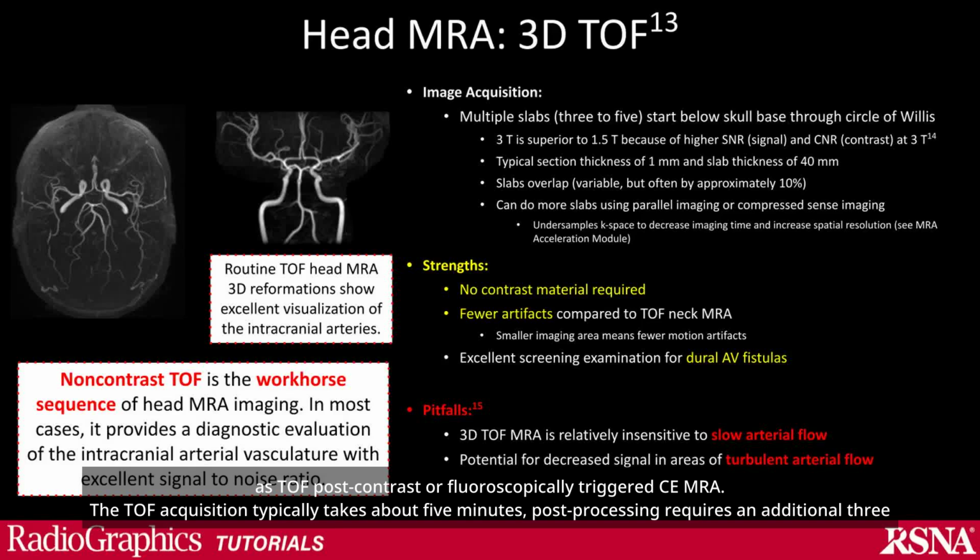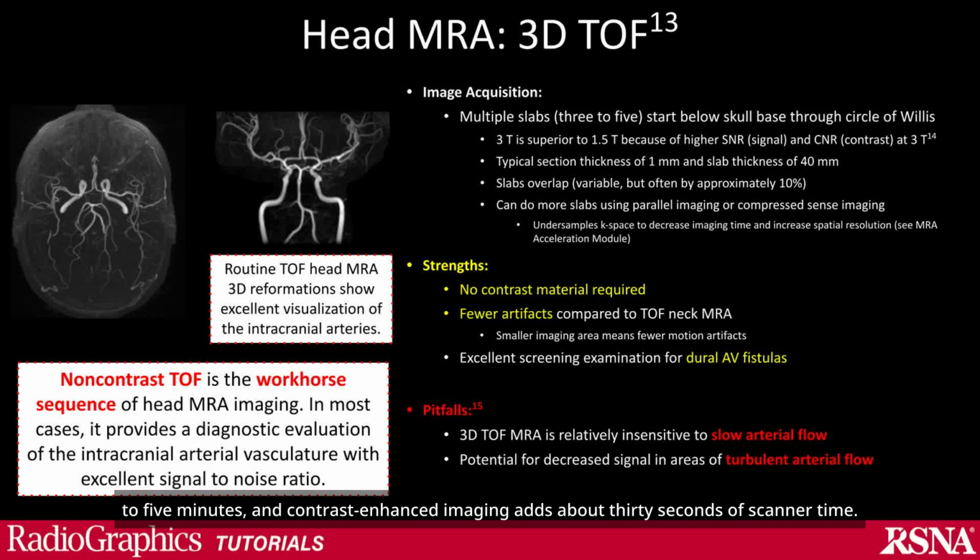The TOF acquisition typically takes about 5 minutes, post-processing requires an additional 3 to 5 minutes, and contrast-enhanced imaging adds about 30 seconds of scanner time.